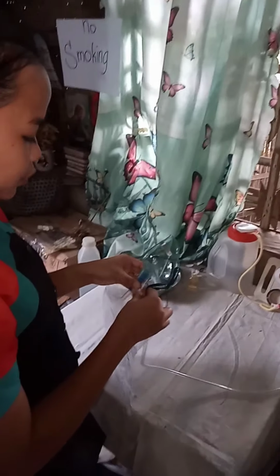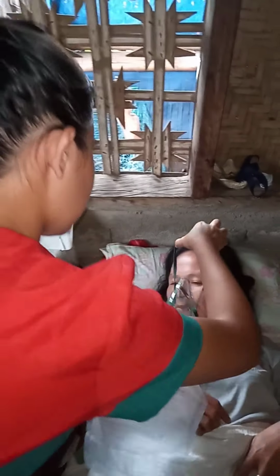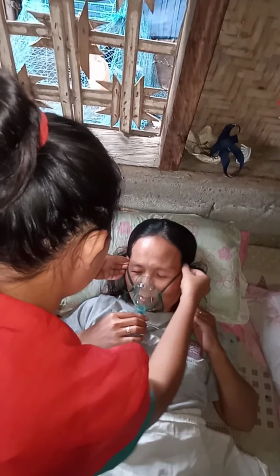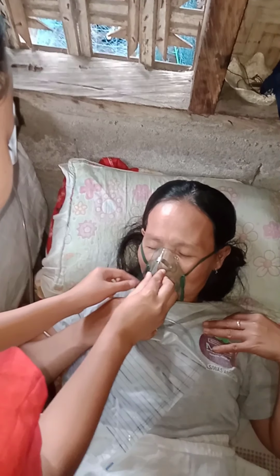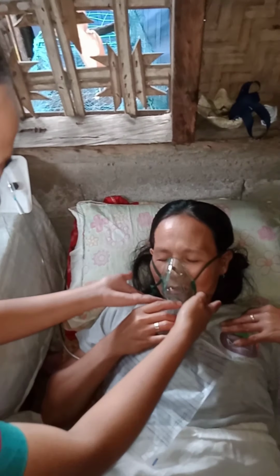Then it is time to attach this to the patient's face. Then you must secure this over the patient's ears. As I said earlier, we need to slightly pinch the nose to secure a good seal. Then let's proceed to the non-rebreather mask.